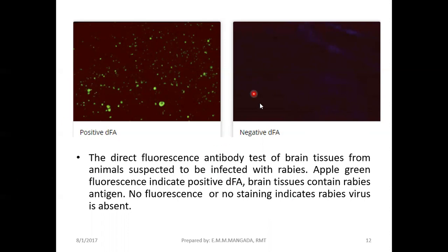Okay? So, you'll be discussing these techniques. So, yung diniscuss ko lang sa inyo guys is direct fluorescence assay. Bakit tinawag siyang direct? Kasi guys, we're just using one antibody to detect the antigen, one antibody. Mamaya kasi pagdating natin sa immunohistochemistry, you will see there, merong technique na gumagamit ng dalawang antibody for the detection. And we call that technique as indirect. Okay, but for this one, it's direct because we're just using one antibody type to detect the antigen.